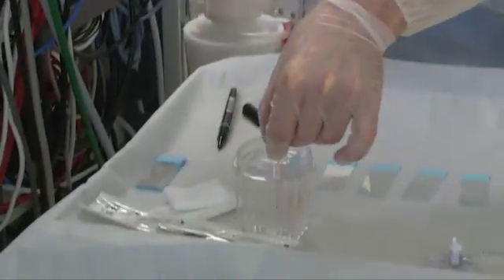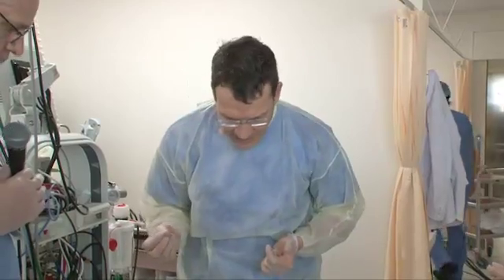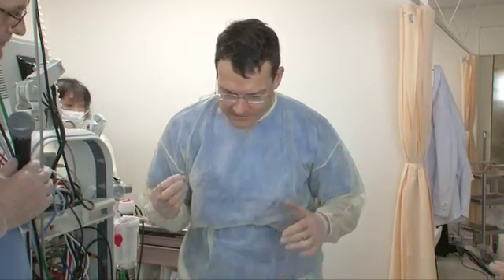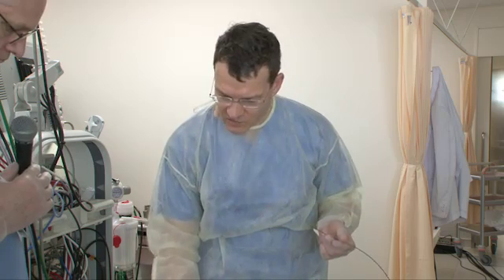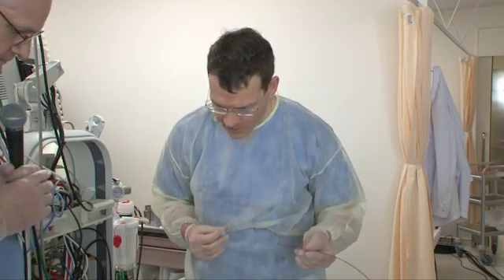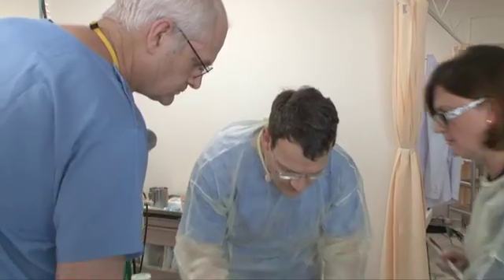We put this immediately in alcohol. This is very important for the cytologist. And now it depends a little bit on the cytologist. Sometimes we use cytolit to put in methanol for cell block. Our cytologists love the cell block. That's why when we have two, three slides with good material, then we put the rest in the cytoblock. So, Stefan, you will not repeat this puncture?